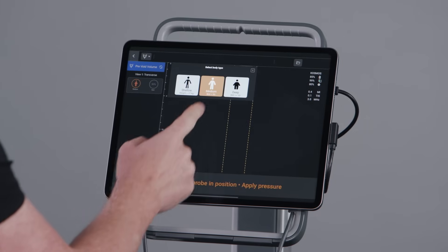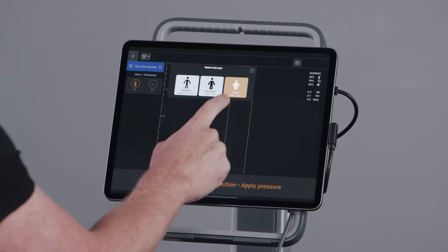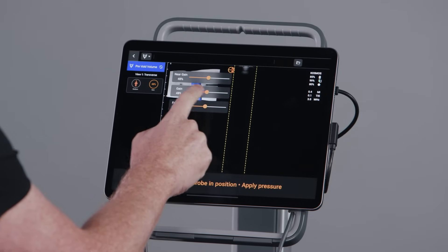Adjusting the body type may be necessary for some patient exams. Cosmos Bladder defaults to a medium body type, which includes a BMI of less than 30. By selecting the body type setting, you can adjust the setting and select Deep for a BMI of 30 or greater, or Shallow for a body weight that is less than 27 kg. Gain allows you to adjust how light or dark the image appears. The default gain is set to 50% and in most cases does not need to be adjusted. By tapping the gain icon, you can then drag the slider to the desired gain level.